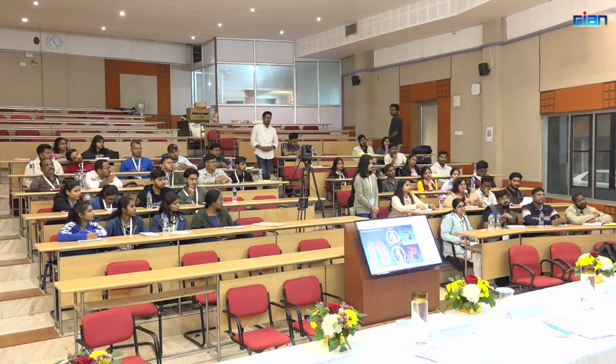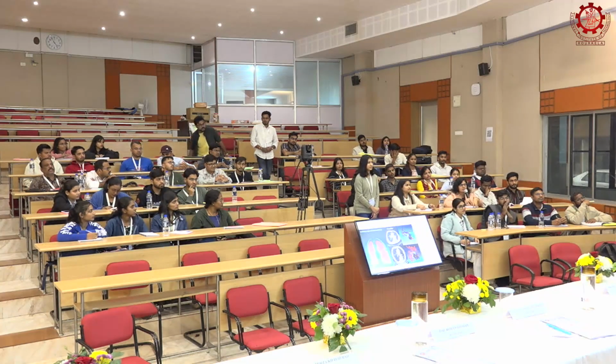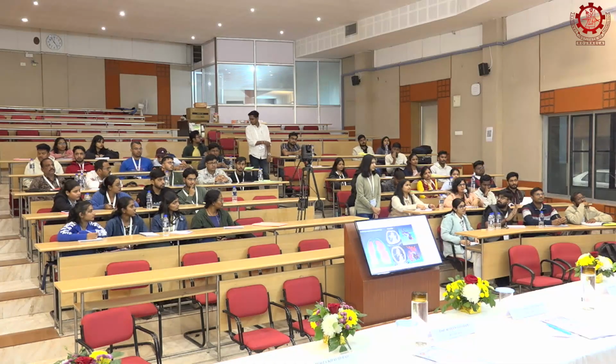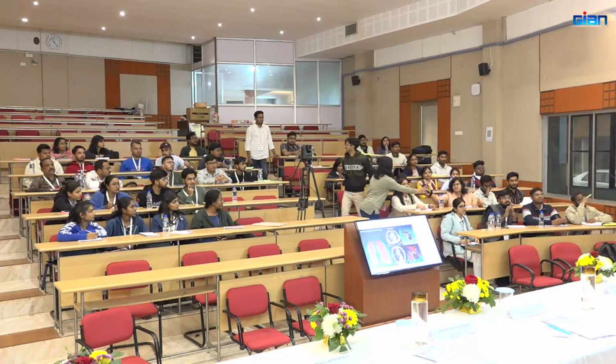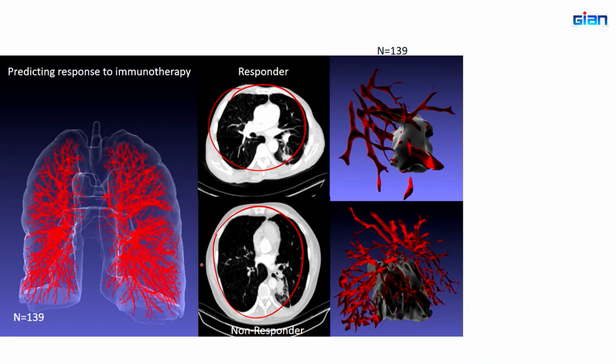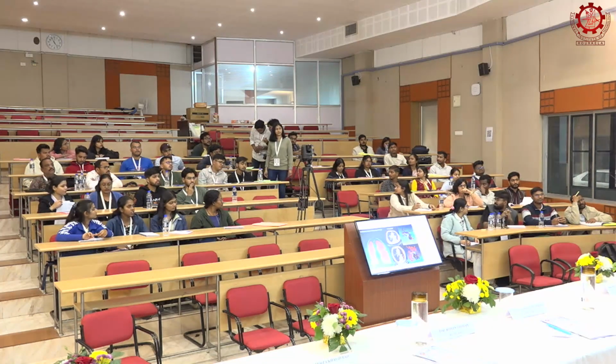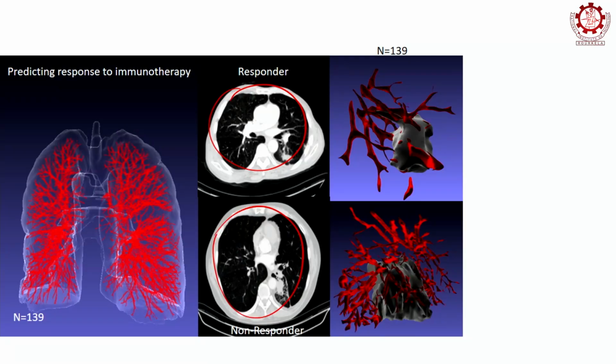So you need the blood vessels. How do you get the blood vessels? Through different imagings, like different scans. Anyone else? So this is a scan that you see on the screen. How will you get blood vessels from this? The quality of the image. In short, how do you get the blood vessels from these images? All that you see here in the image, you see the 2 lungs, and you have some blood vessels dispersed in the lung. How do you obtain them?